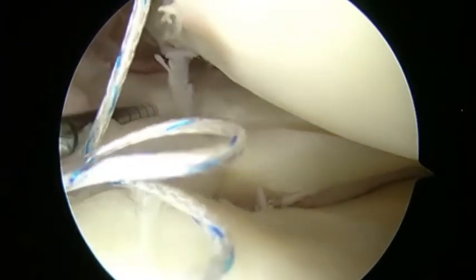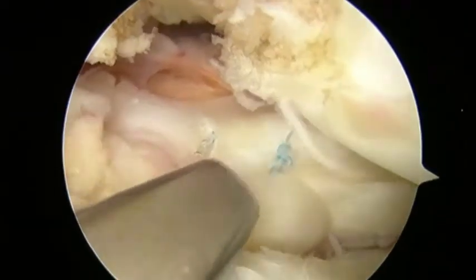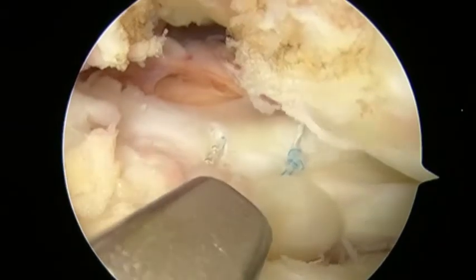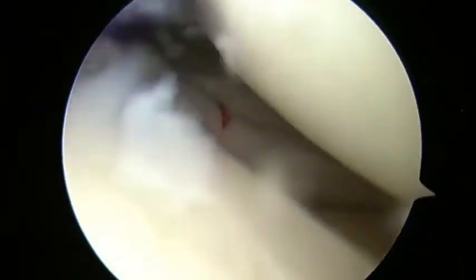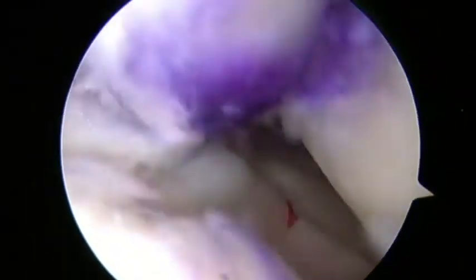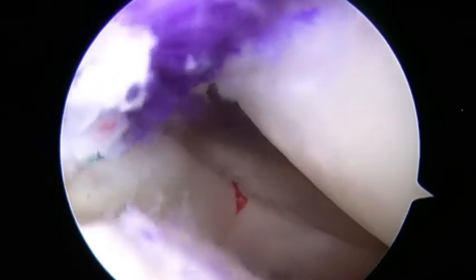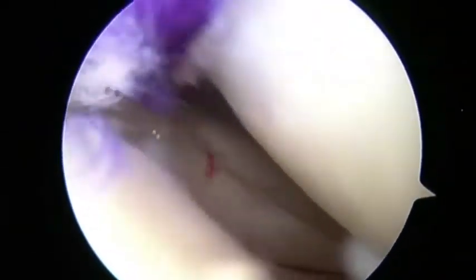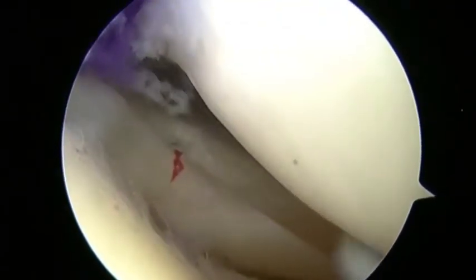The two side-to-side stitches repair the radial root tear with no change in the natural meniscus anatomy and tension. You can see that even when the knee is hyperflexed for trans-portal femoral tunnel drilling for ACL reconstruction, the repair remains stable.